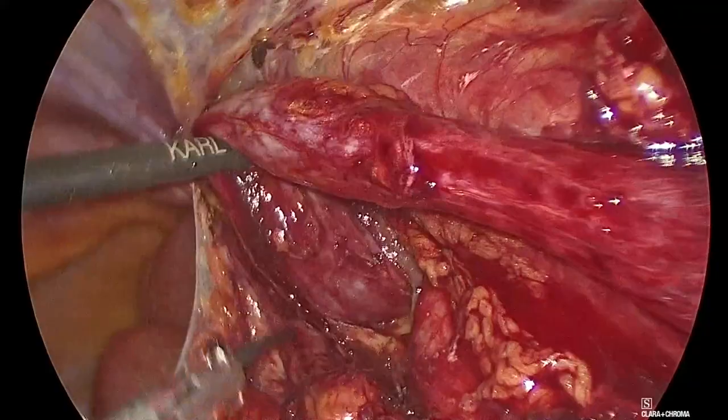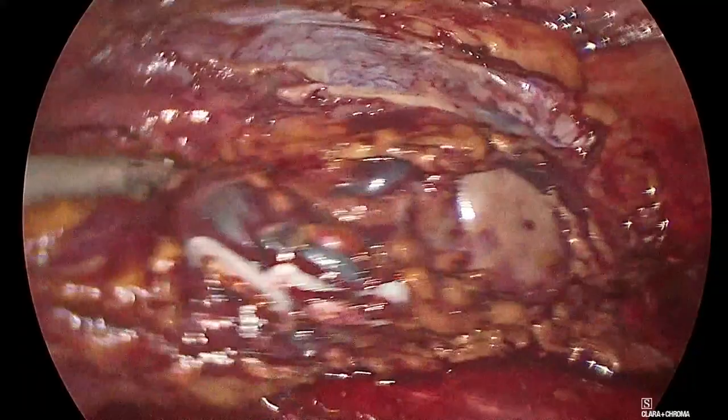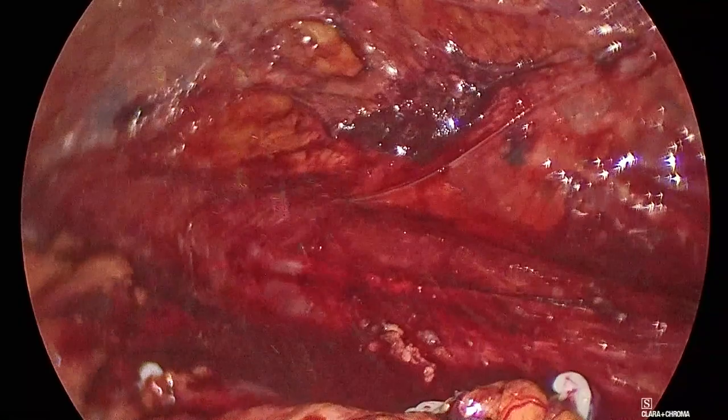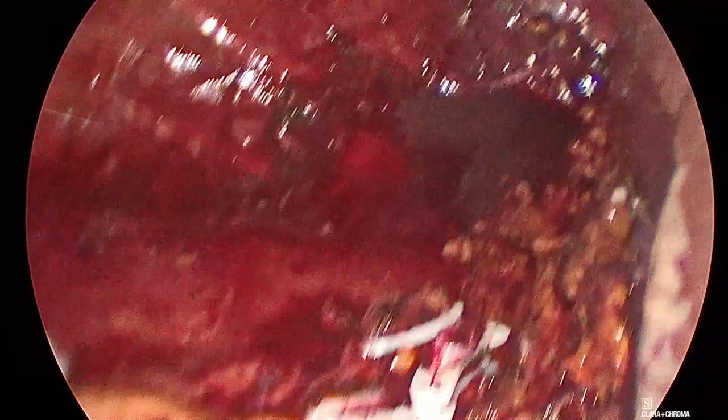Okay, so now everything is off. So the ureter, you see, you follow all the ureter. So I don't think there's anything else we should do. We just bring the kidney down and we put it right at the level of where we want to make the incision. So now we just need to clean the field a little bit. We just wash a little bit here and there, and then we will open.